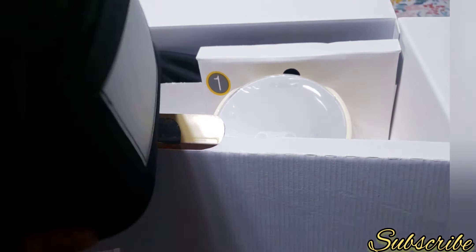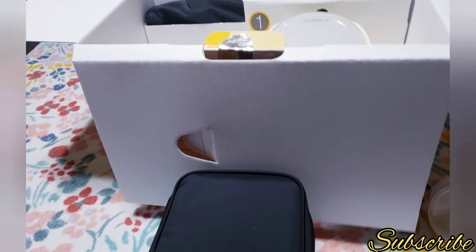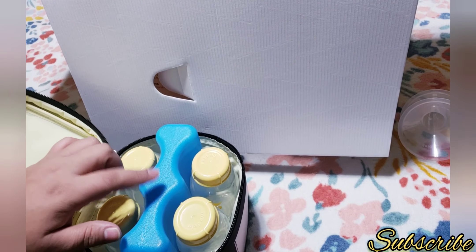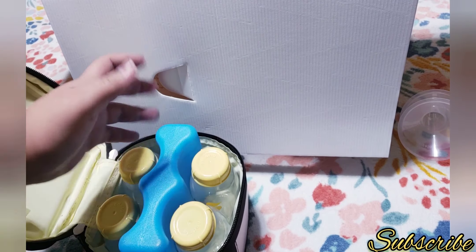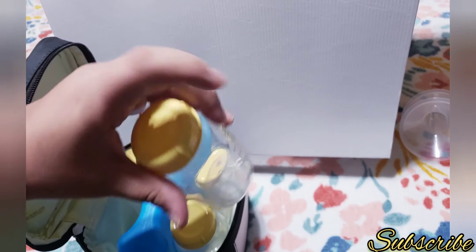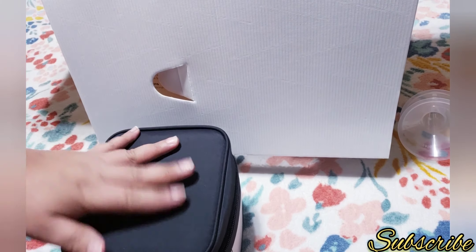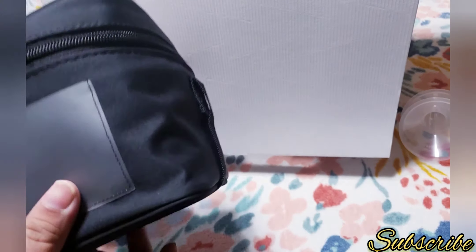In here you can see it comes with this little cooler bag. Let me show it to you. On the inside it comes with a cooler insert with ice so the milk won't get ruined. It also comes with four 5-ounce Medela bottles with caps. That's really great for mothers that work or are on the go.